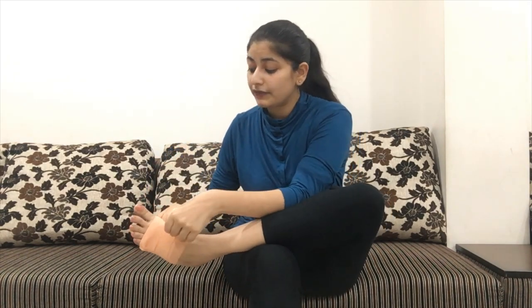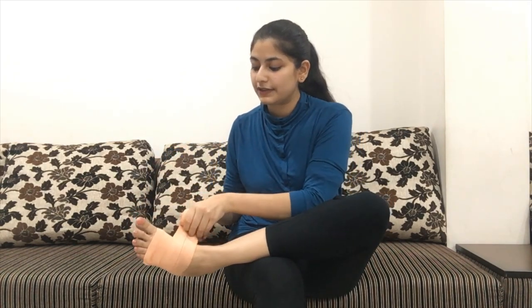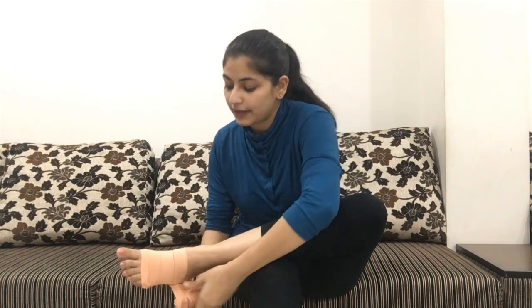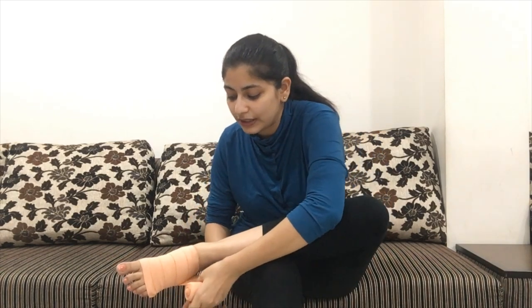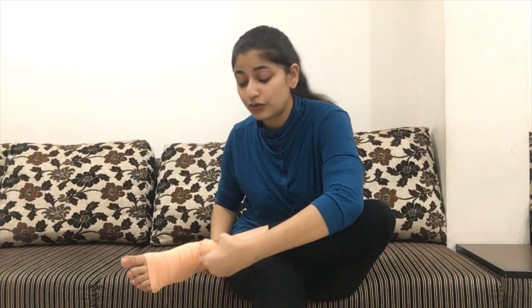Again if you see, I am overlapping over half of the bandage, and then we move ahead. So this is like the third round, then another round. Aur iske baad mein, hum yeh heel area ko spare karte hain. Uske upar se hum yeh crepe ko nahi le jaate hain. So yeh round hone ke immediately baad mein, yahan nahi lete hue, usko directly upar le jaate hain. Aur ankle region ko leave out karte hain.